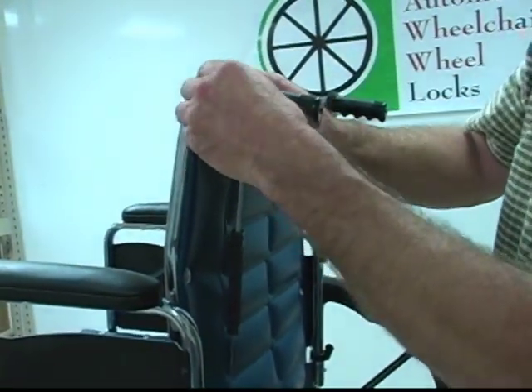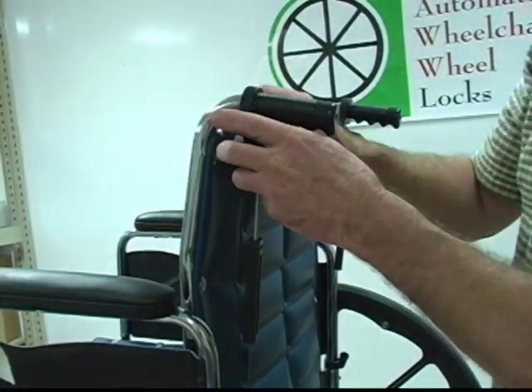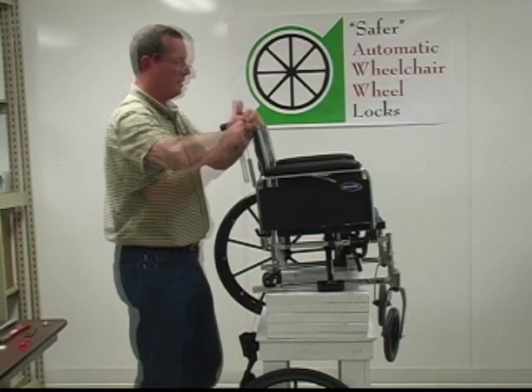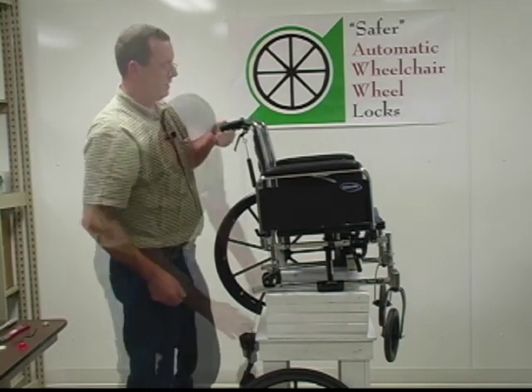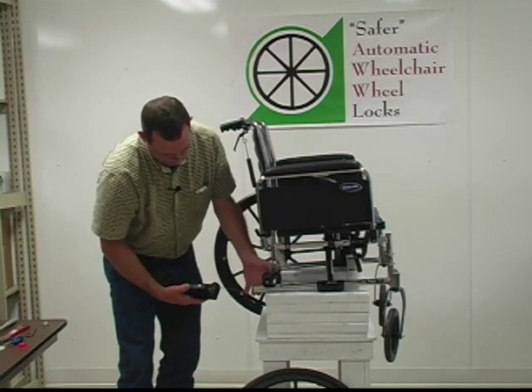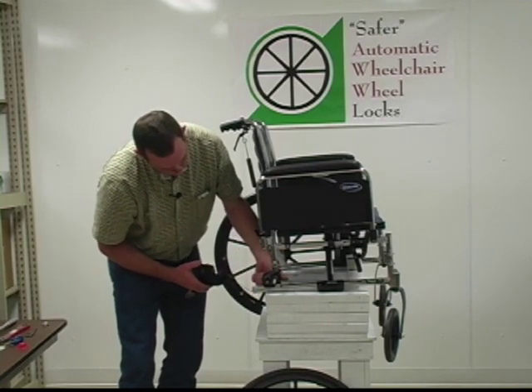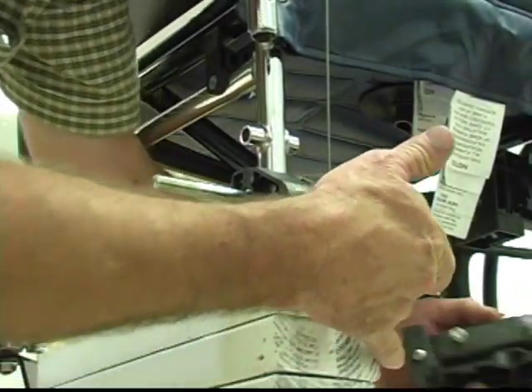We'll stretch it out, put it onto the handle, and then tighten that screw up. That'll take a Phillips head screwdriver. This also will need to be tightened firmly so it won't twist on there. All right, next we'll take the paddle assembly and install it. We want to do the same thing here. This cable will come under the cam assembly right there.